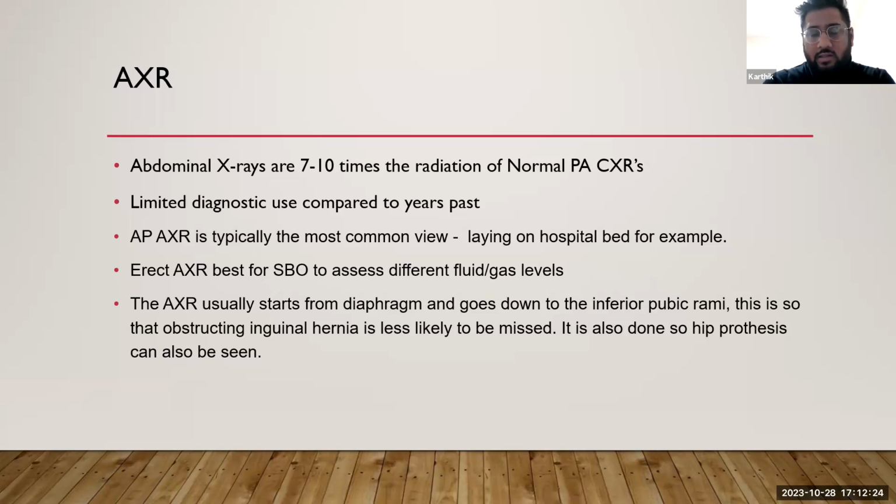Such as appendicitis, bowel obstruction, because even though one of the main uses of abdominal X-rays is for bowel obstruction, we can't always see it on a plain abdominal film. Obviously, we rely on the clinical findings and the history, so we will have a tense abdomen, or they haven't passed stool for a couple of days, haven't passed any gas. So it's a combination of the history and abdominal X-ray, and then we get the CT based on those 2 things.